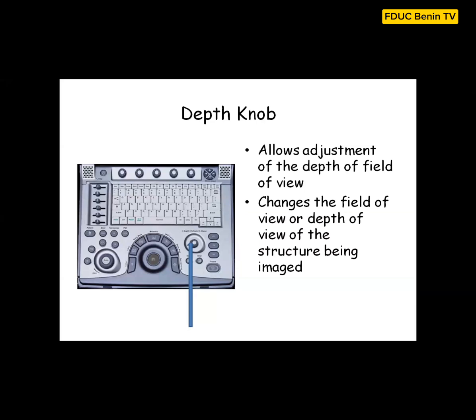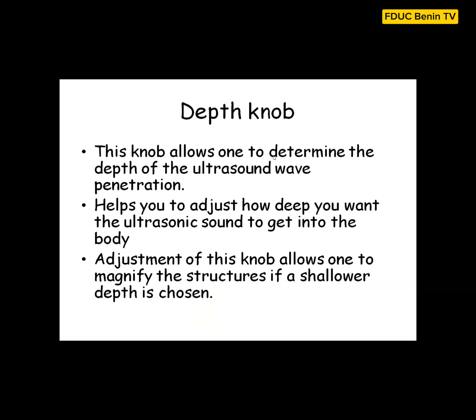That is what this button does for us. It can help you to determine how deep you want the ultrasound wave to penetrate the area of study. It helps you to adjust how deep you want the ultrasound to get into the body.